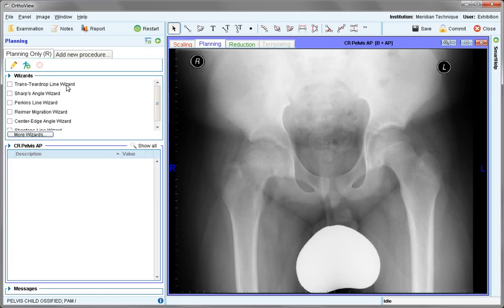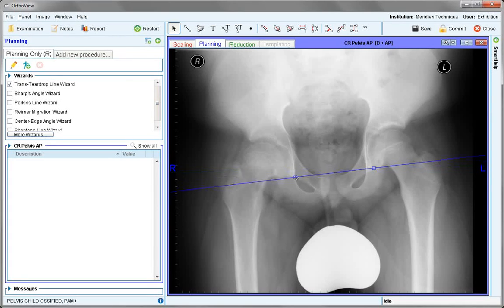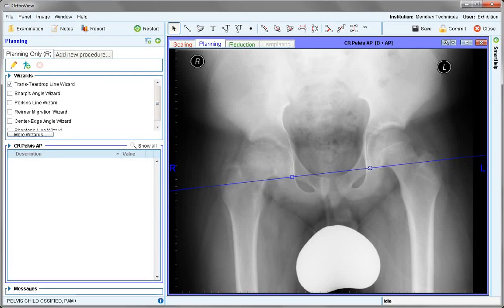To begin with the trans teardrop line, which is the baseline for other measures, both of the handles sit on the base of the teardrop structures, or the U, as shown in this child pelvis. This removes any obliquity issues from the pelvis.